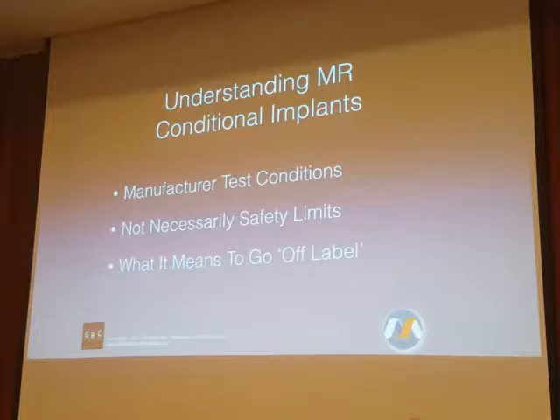So this manufacturer had gone through the test. They had done the extrapolation to figure out how much higher they could label it. And they sent their calculations to me to review. And I took a look at the calculations and I said, there's a math error here.